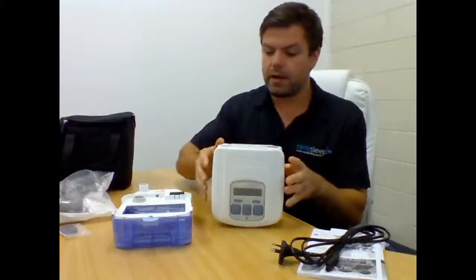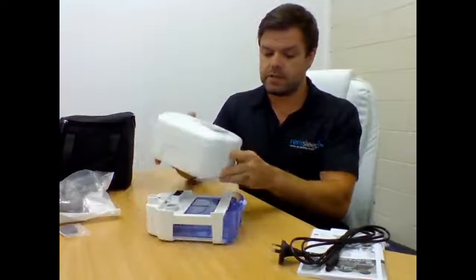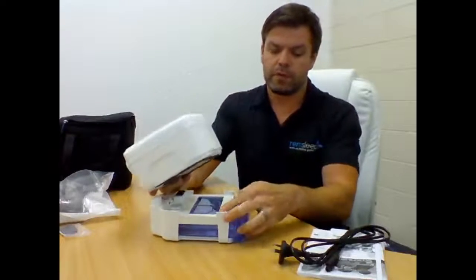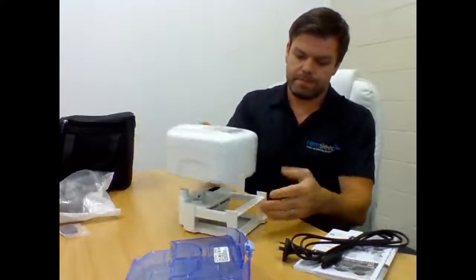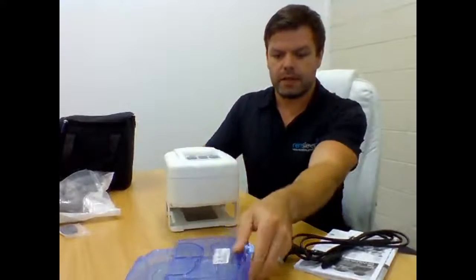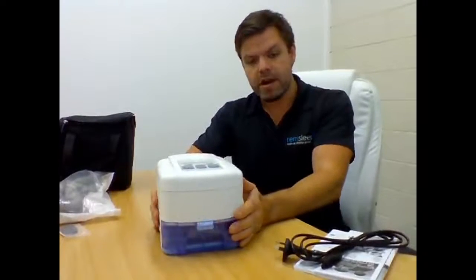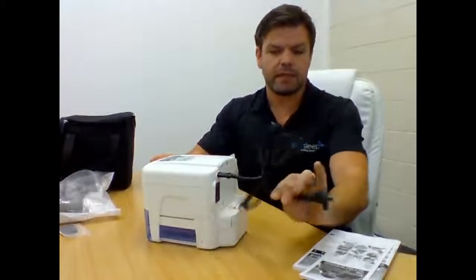So this is our humidifier here. The machine itself is really easy to sit on top there. So all we do is just at the front of the machine, if you've seen some of our other videos, there's a couple of little grooves, and all we do is just take that chamber out the front there. You can just place the machine on top, and then the humidifier chamber just goes into the front there. So that's our little unit now, completely set up, ready to go. The power cord just fits in the back here, and the other end into your wall.